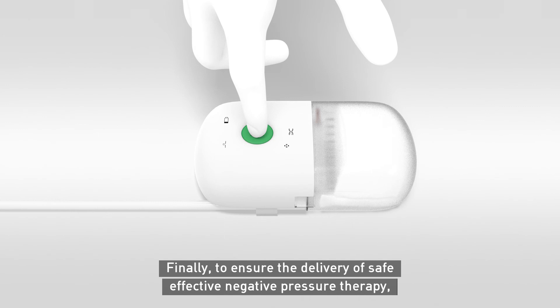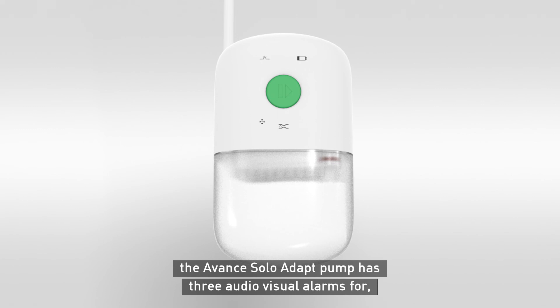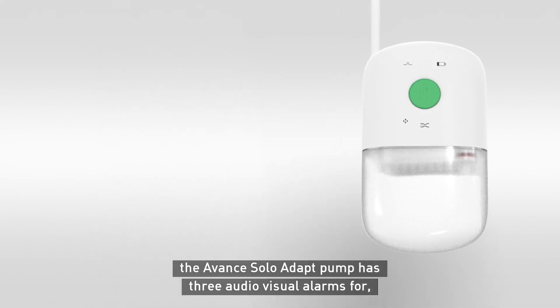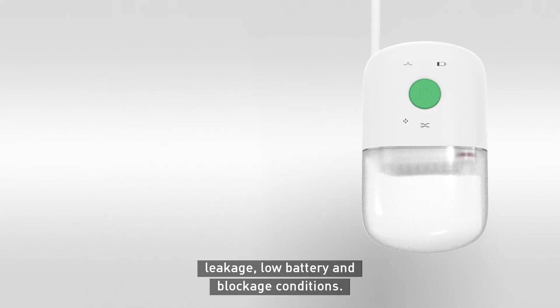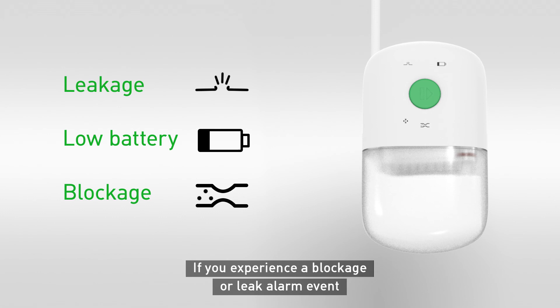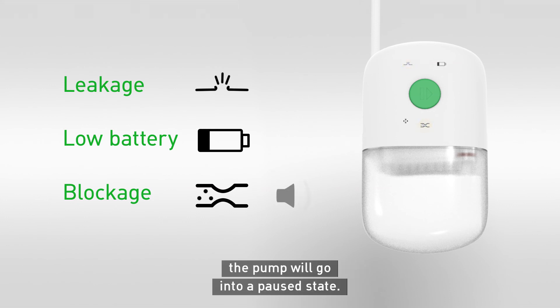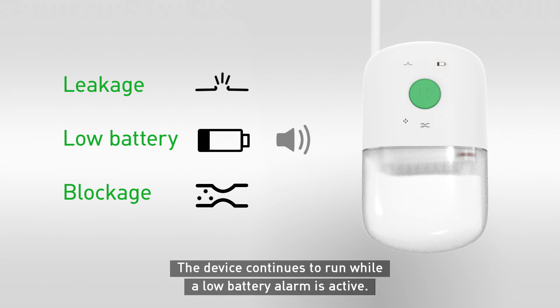Finally, to ensure the delivery of safe, effective negative pressure therapy, the Avance Solo Adapt pump has three audiovisual alarms for leakage, low battery, and blockage conditions. If you experience a blockage or leak alarm event, the system will issue an audible alarm and the associated alarm symbol will illuminate. The pump will go into a paused state. The device continues to run while a low battery alarm is active.